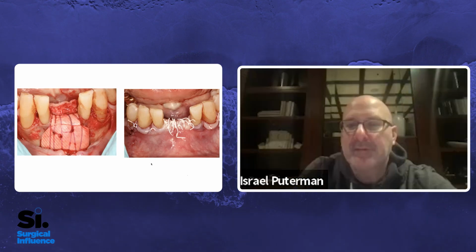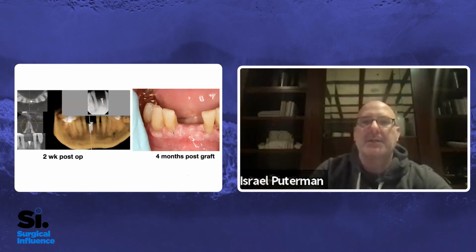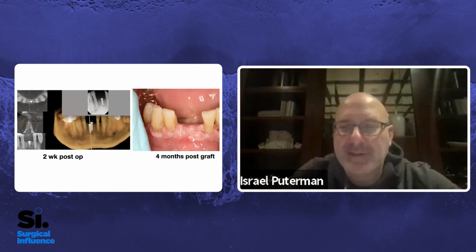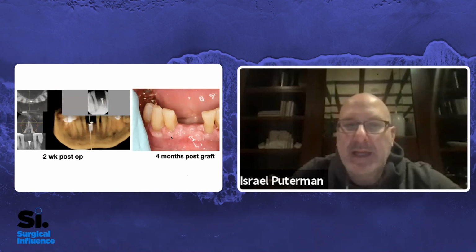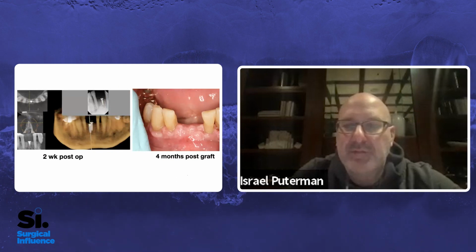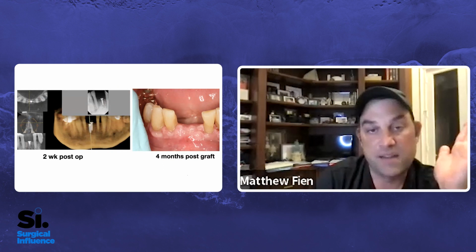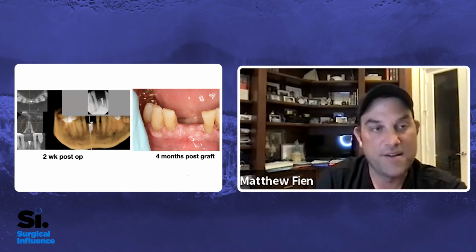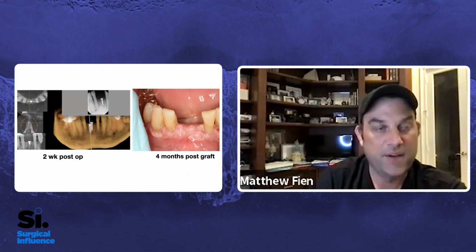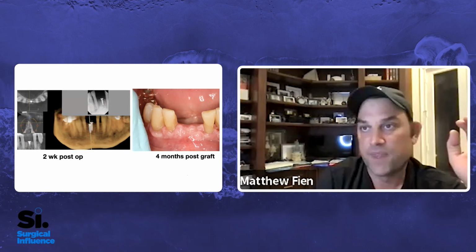Yeah, I agree. I might go exactly like you, a little easier on the suturing, and use Glycolon. It's just a little more tissue friendly, I think. Finer suture, and I'll admit it, I'm getting lazy. For me to be able to have sutures in there and know that I don't have to be digging them out at 2 weeks or 3 weeks, it's a huge advantage.